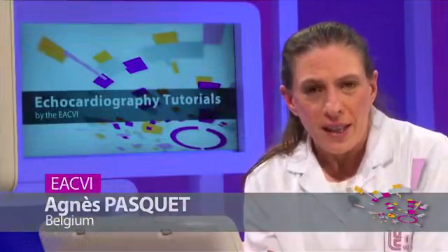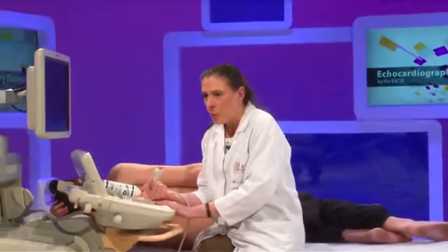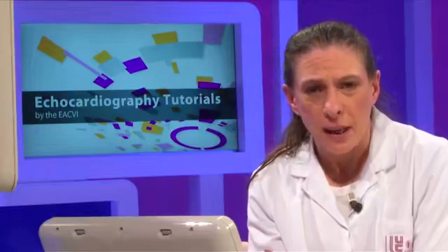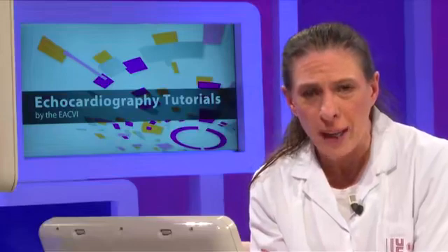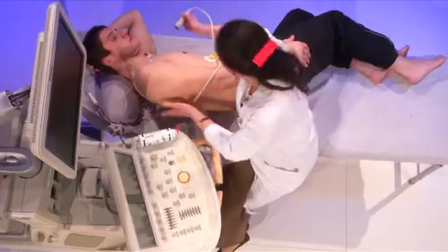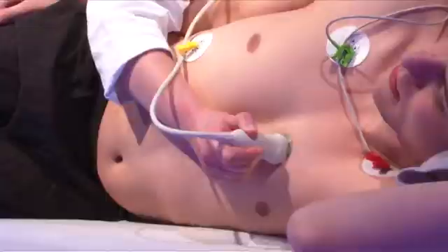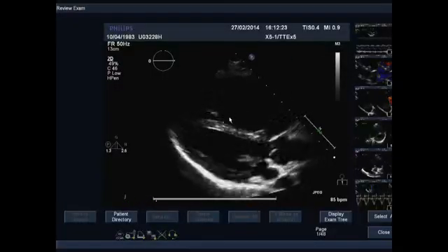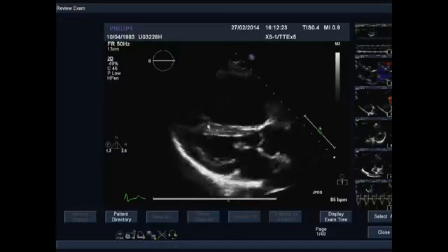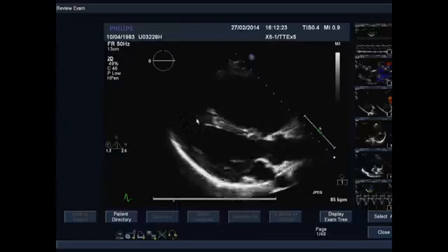The physical examination shows a delayed second sound at the pulmonary location, and this guy complained of dyspnea on exertion. So as usual, I will start the examination with the parasternal long axis view. This view is quite uncommon, and you see already that you have a very large right ventricle here, and you can have a look at this quite particular motion of the septum.